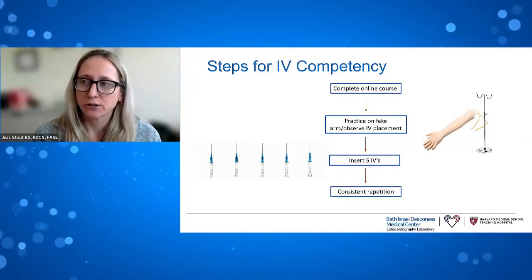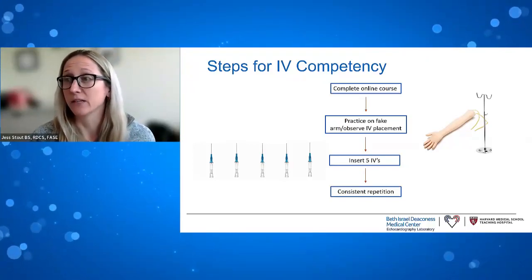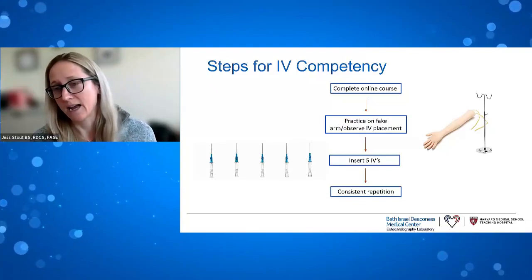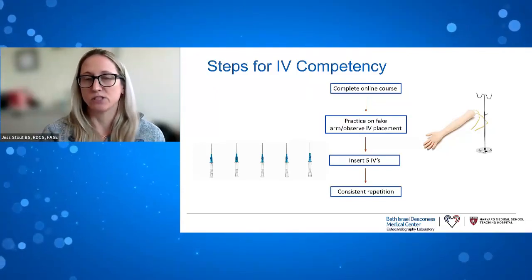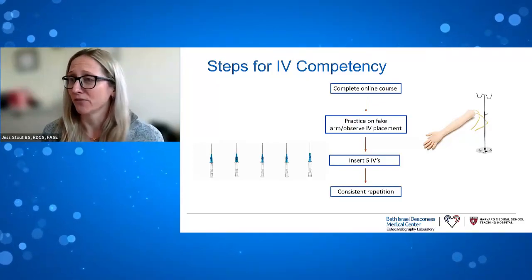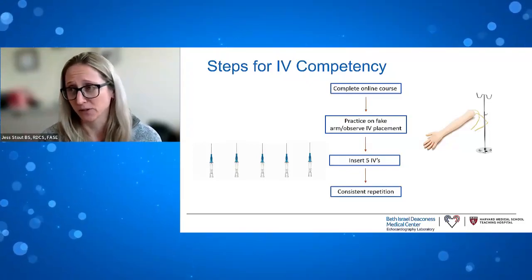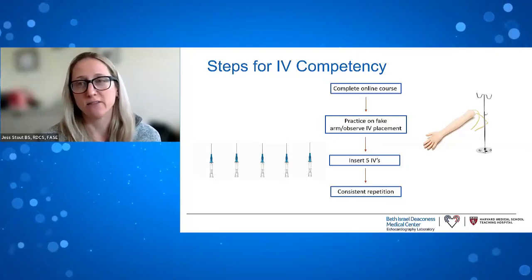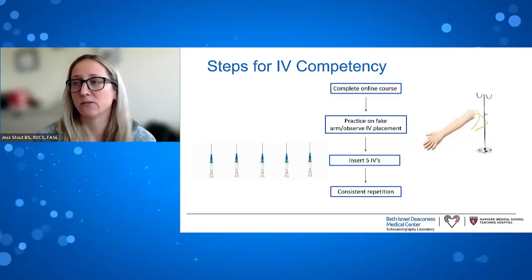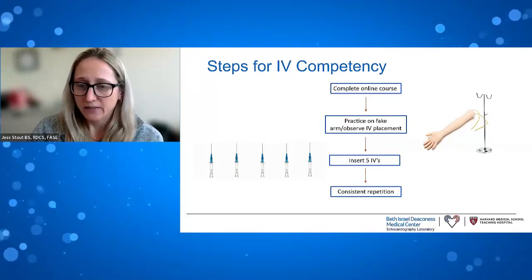So I restructured it a little bit recently, and I have one of our more veteran sonographers that's been IV certified for a long time coming on site for full weeks at a time and just being the IV resource. She's there on the first day to teach a didactic and go over things. And then she's there for the full week to help you and put IVs in back to back, be a resource for you. So if you're considering implementing it, having a person that can be that consistent resource is really helpful. So that's for the IV starts.